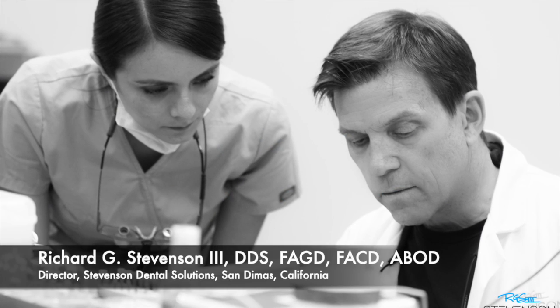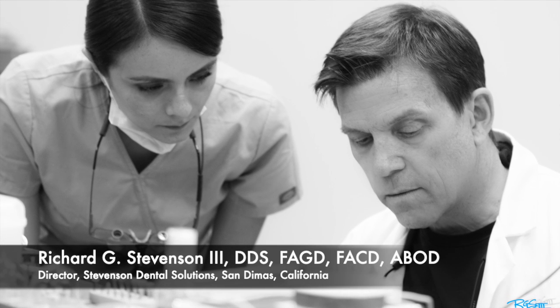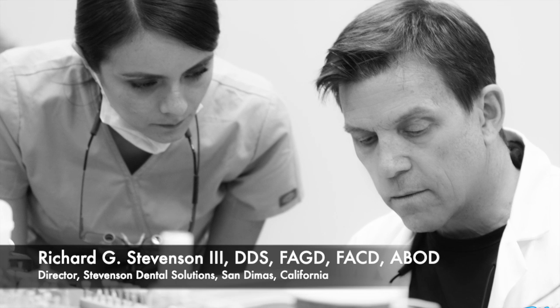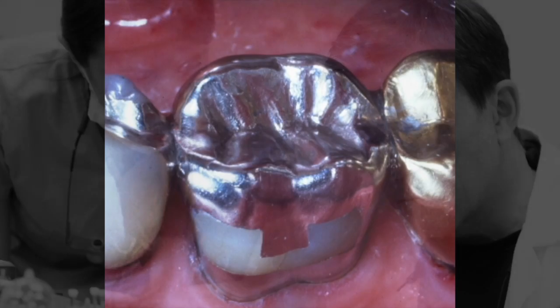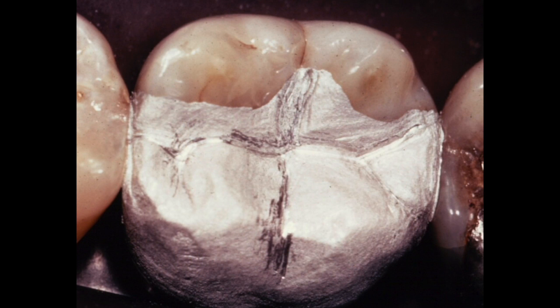Hi everybody, I'm Dr. Richard Stevenson and I'm the director of Stevenson Dental Solutions in San Dimas, California. Today we're going to talk about the complex amalgam, and this is a three-part series. A complex amalgam is something like this - it replaces one or more cusps on the tooth, can be retained by pins or boxes, and may cover half of a tooth.